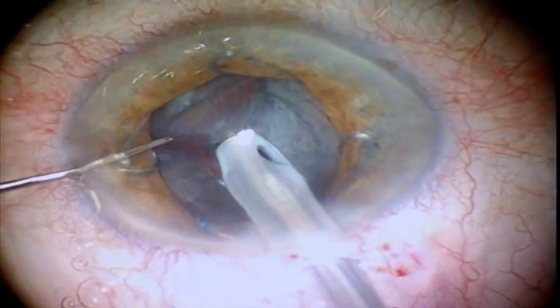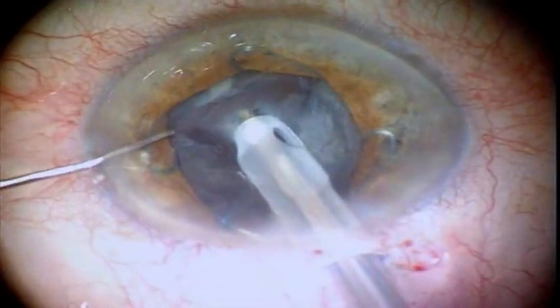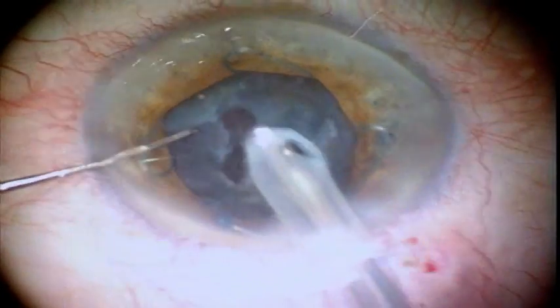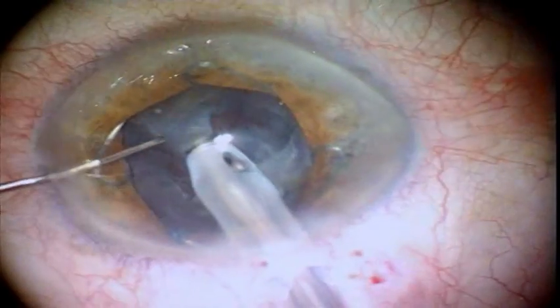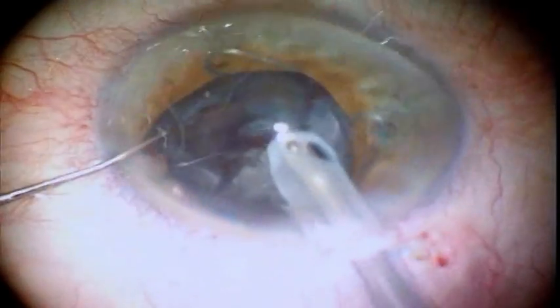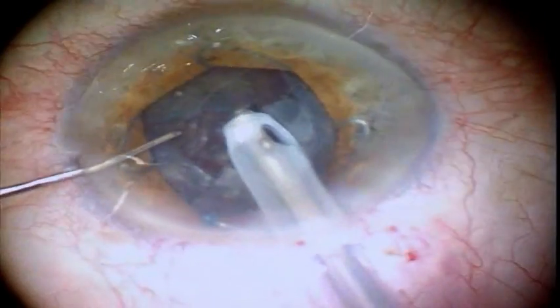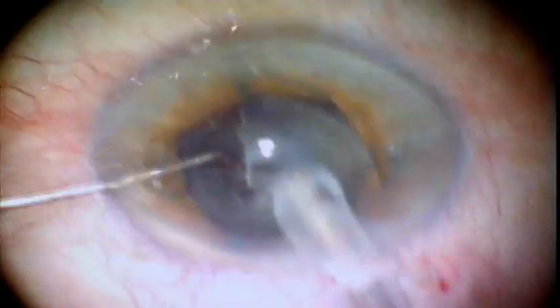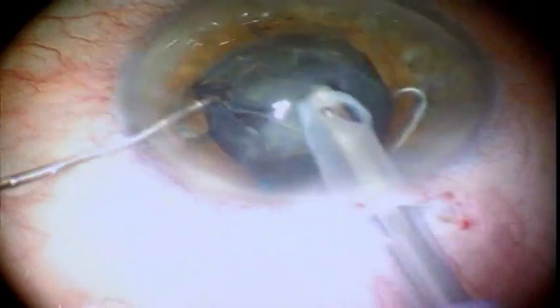Secure iris fixation provides sufficient access to the nucleus. The surgeon can use any technique of nucleus disassembly, including divide and conquer, phaco chop, or pre-chop. Bimanual manipulations in the anterior chamber are not restricted by the ring, and the iris remains stable throughout the procedure. There is virtually no risk of iris aspiration into the ultrasonic needle.